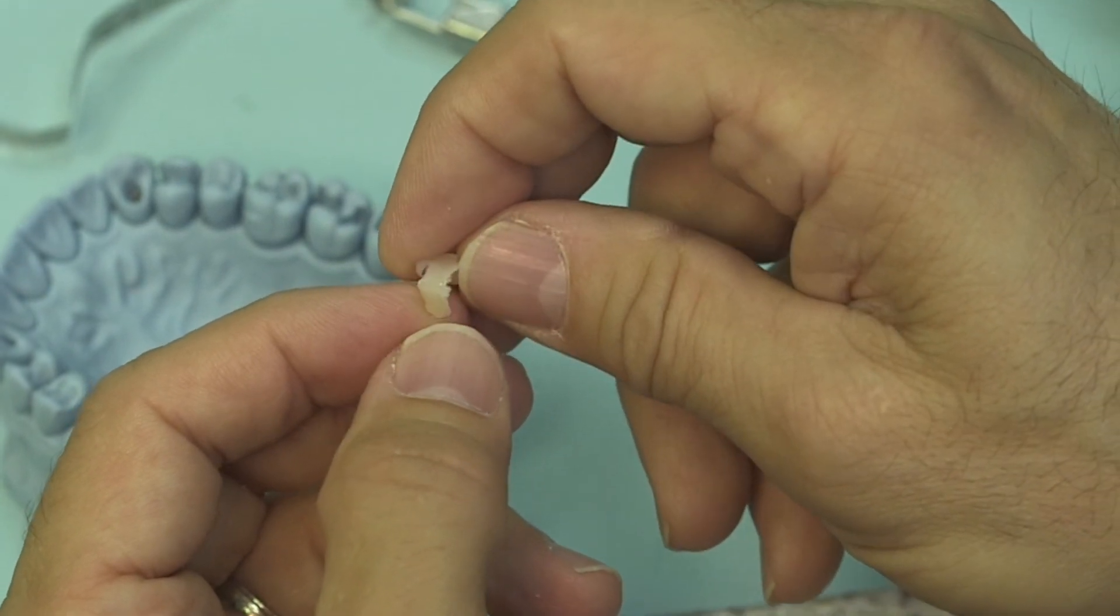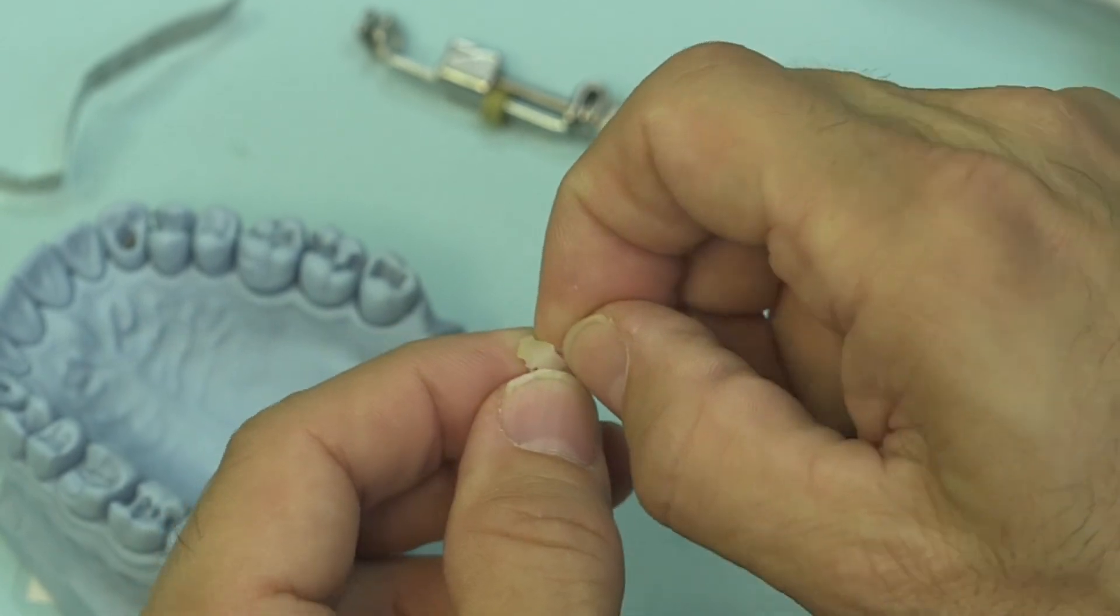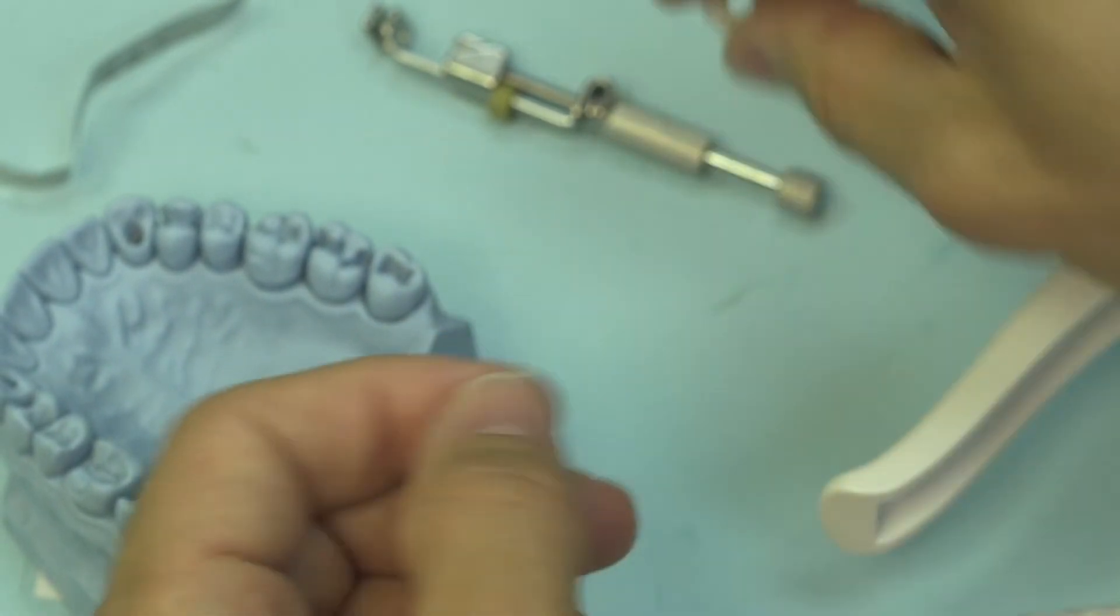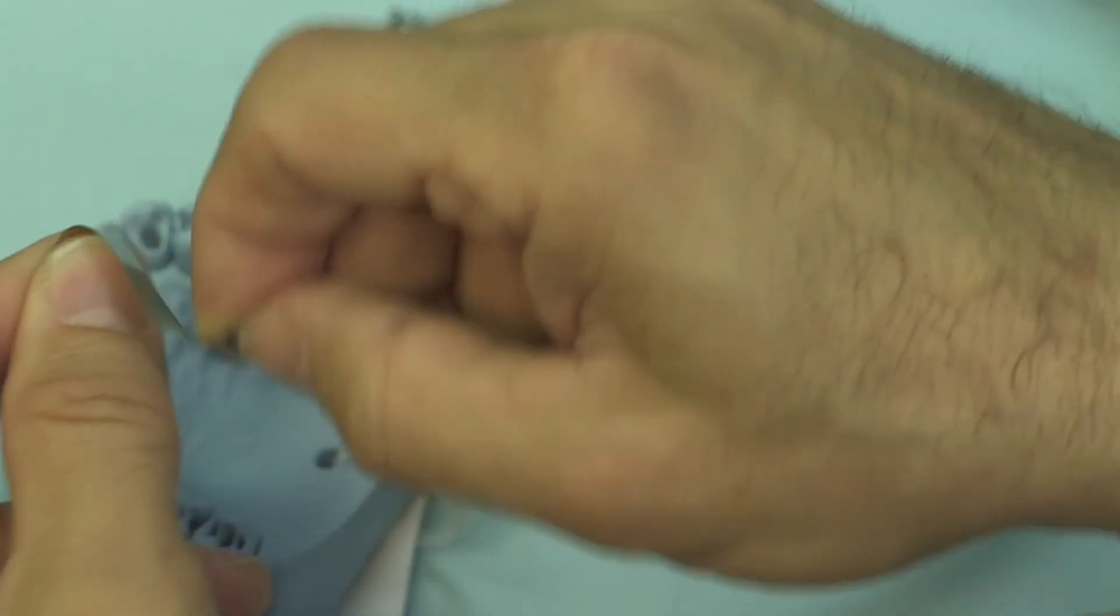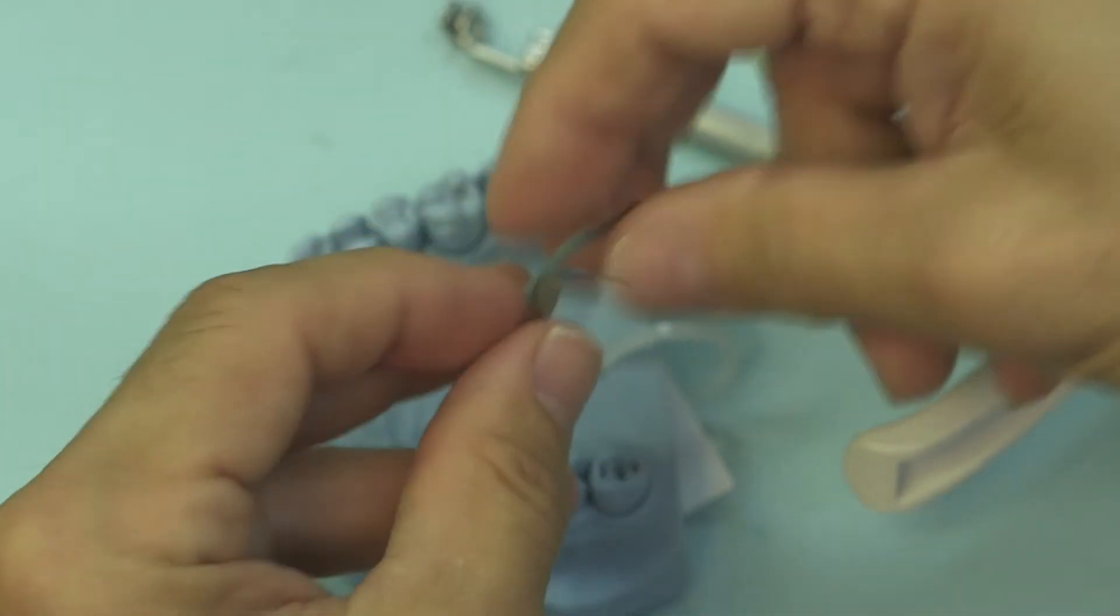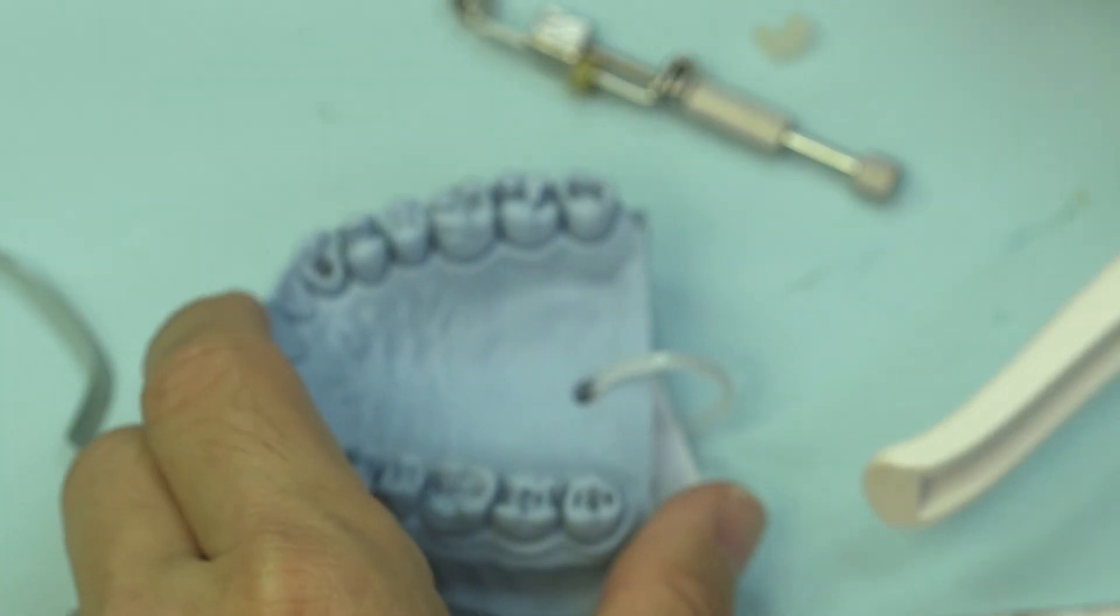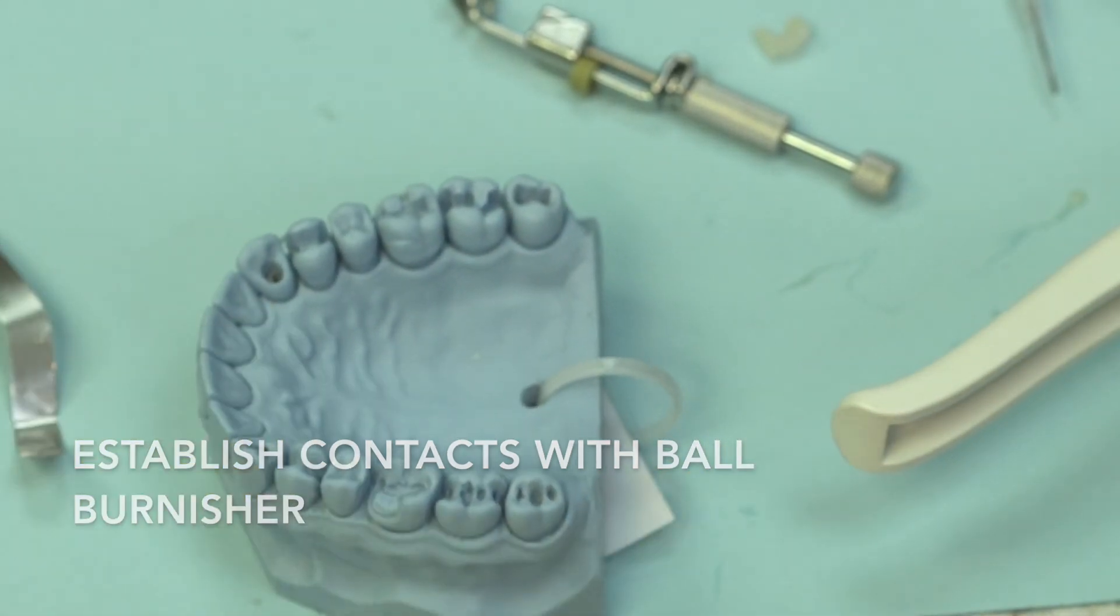Now people ask all the time, John, this is an injectable material that's fairly viscous, but how do you get good contacts? Well again, contacts are going to be created by how you manipulate your band. If you do not wedge and put your band on properly and create contacts with your band and a good ball burnisher, you're never going to get good contacts.